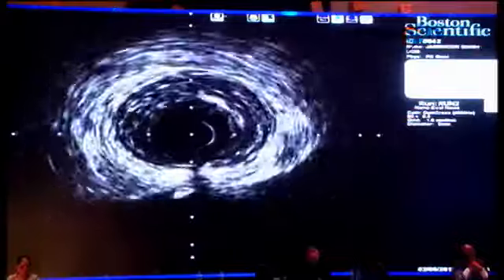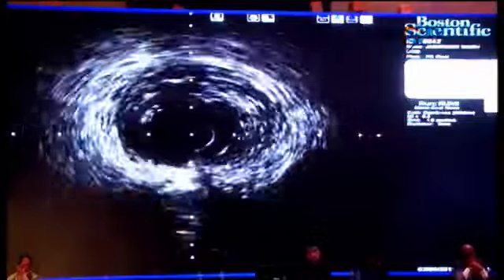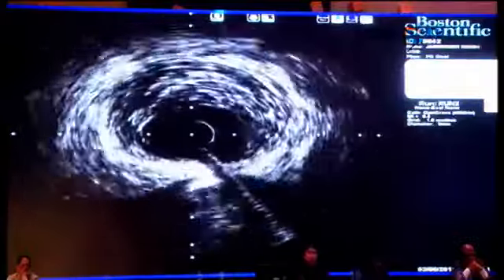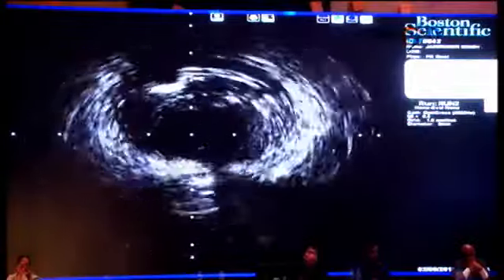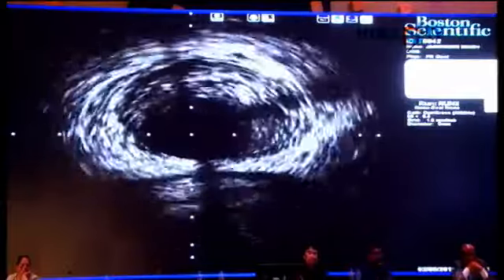So we really see it's soft fibrous in the plaque, intraplaque. Yeah, intraplaque we have. I think we crossed intraplaque, the whole lesion, most likely. Yeah, definitely. So this gives us a clear picture. Small speck of calcium. We can stay with one stent, with this strategy.